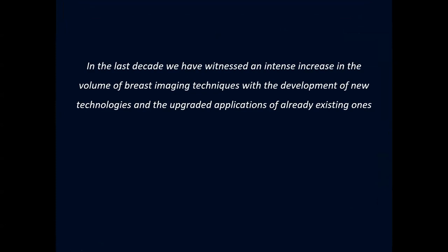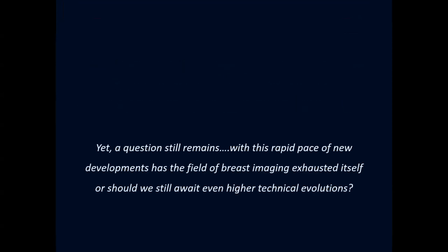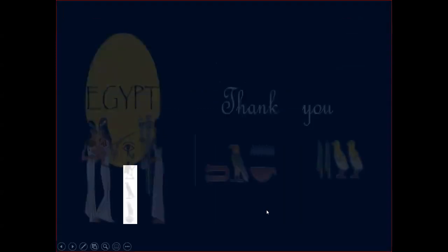And definitely in the last decade, we have witnessed an intense increase in the volume of breast imaging techniques with the development of new technologies and the upgraded applications of already existing ones. Yet a question still remains: with this rapid pace of new developments, has the field of breast imaging exhausted itself, or should we still await even higher technical evolutions? And thank you.